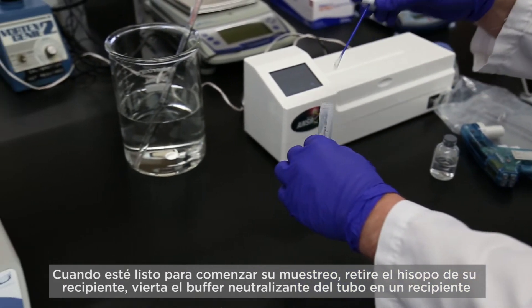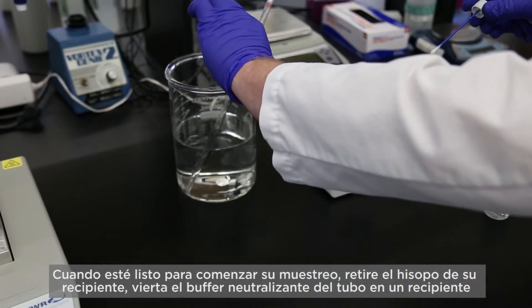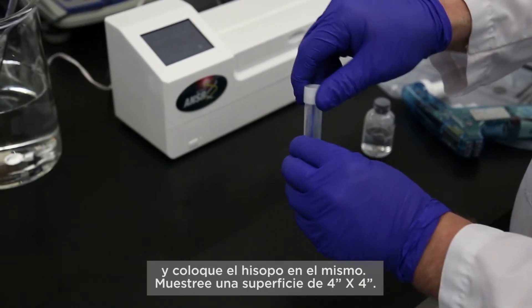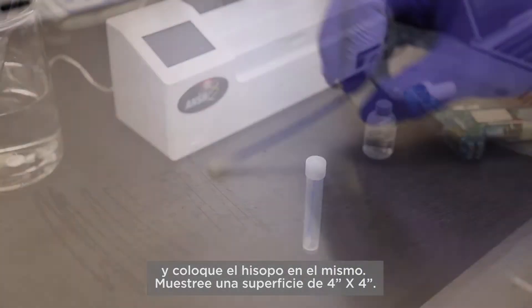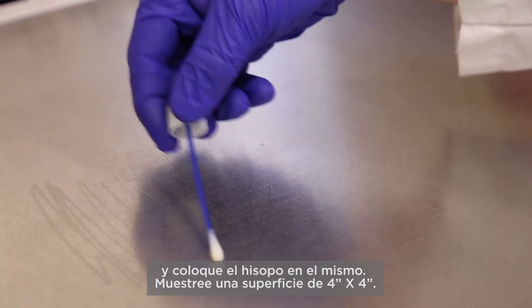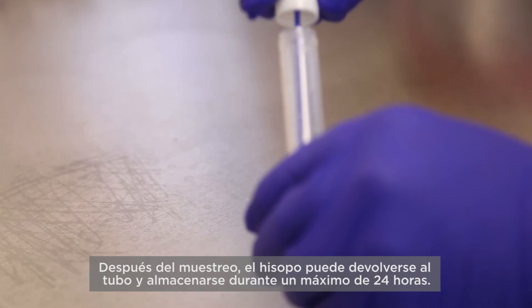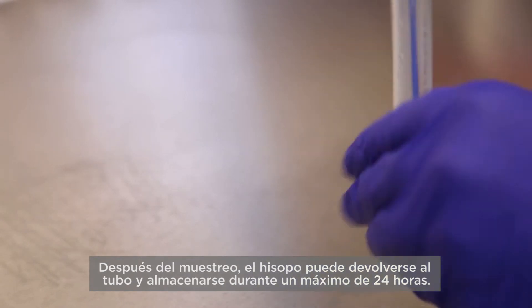When you're ready to start your sampling, remove the swab from its container, decant the neutralizing buffer from the tube into a receptacle, and place the swab back into the container. Sample a 4 inch by 4 inch surface. After sampling, the swab can be returned to the tube and held for up to 24 hours.